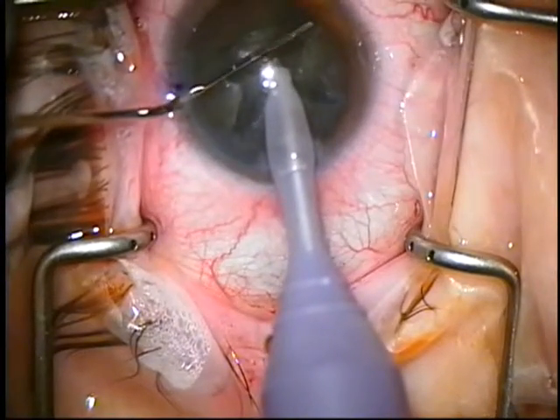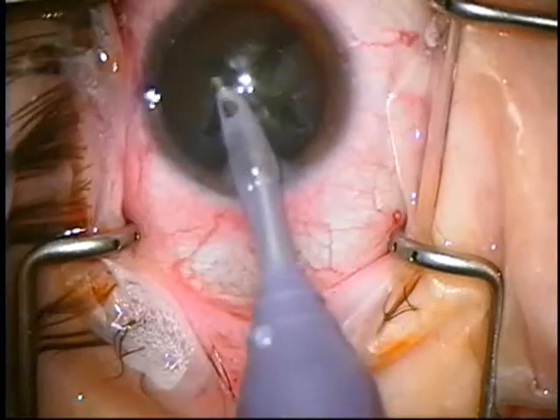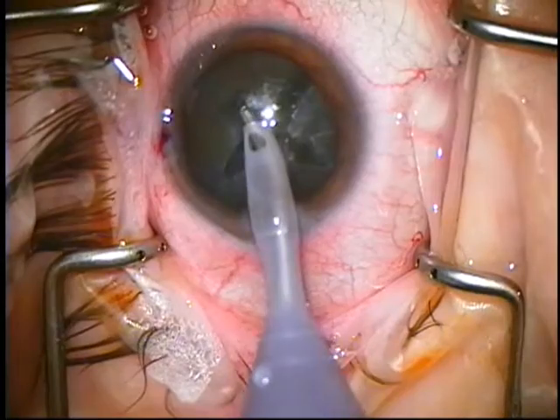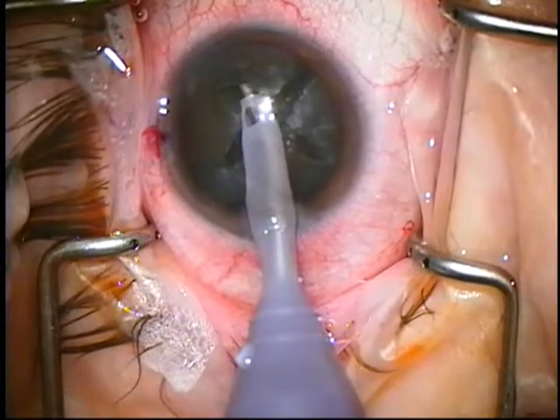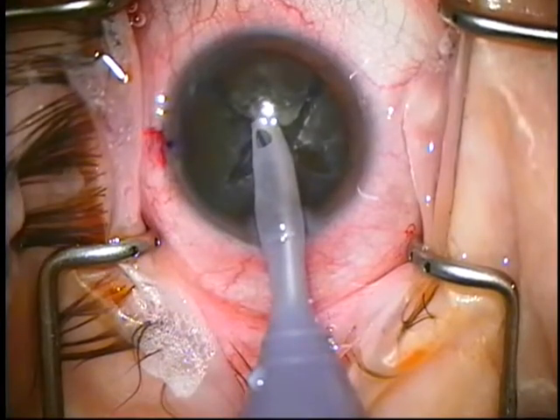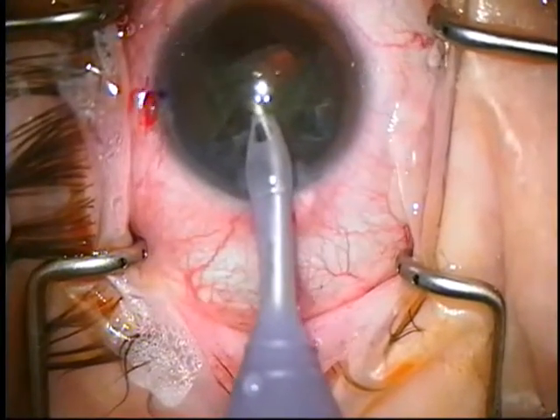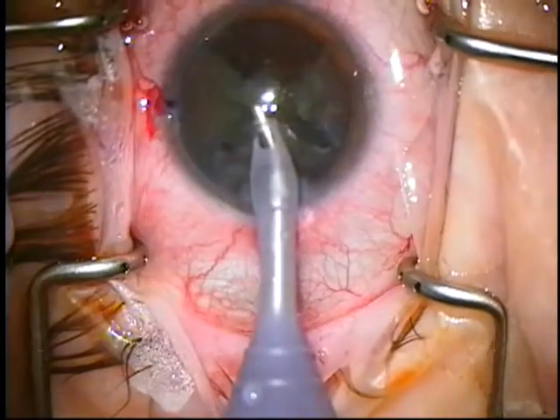I'm going to turn a half quadrant, one-eighth. I'm going to place this at the left mid-wall, aspirate, and slowly pull. No phaco is used until I get dead center, and then I use it when I'm here.